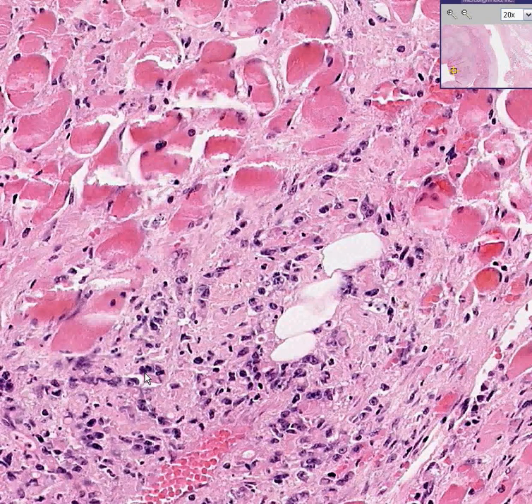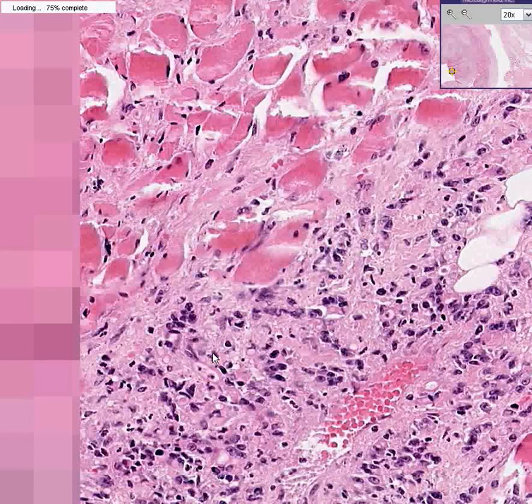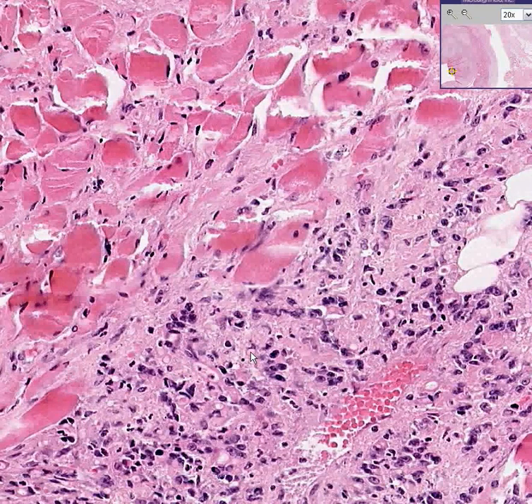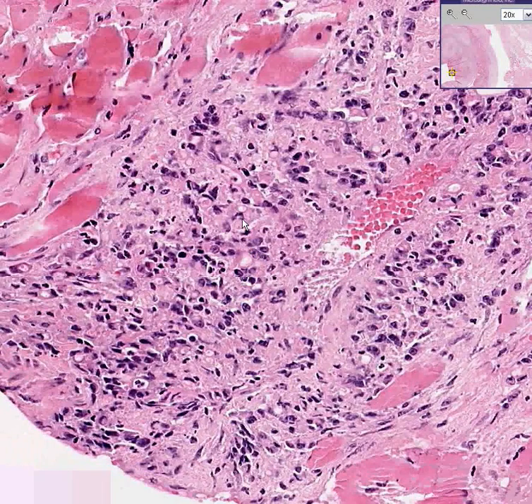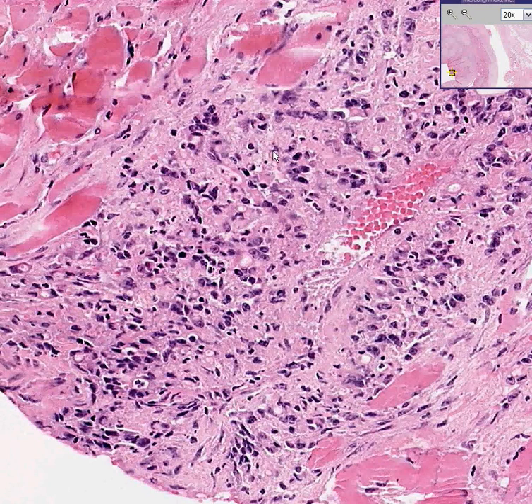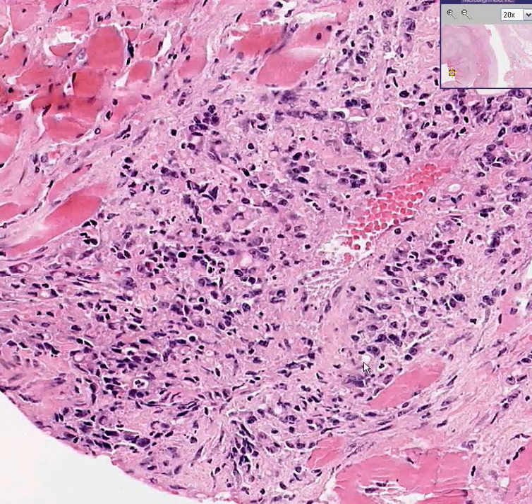In some areas, you can see a signet ring cell in which the nucleus is a little bit displaced and the cytoplasm is filled with a mucinous type material. Here's another tumor cell, perhaps with the signet ring. But in some areas, the tumor cells form almost abortive type glandular formations.